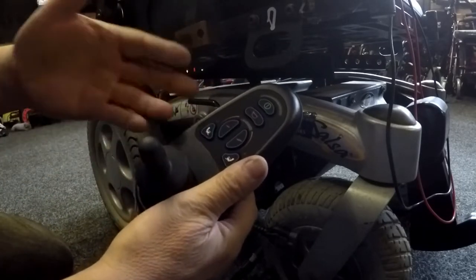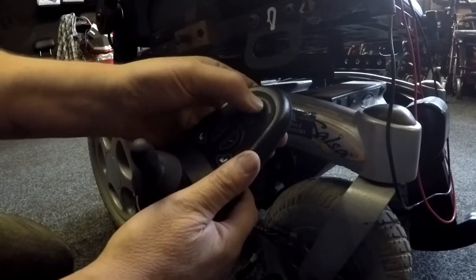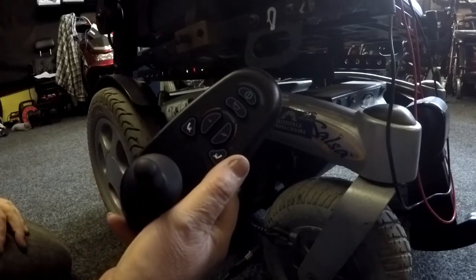There is a problem. There's somewhere a problem. Switch it on, it switches itself back off. It went on there, the electric brakes went, and now it's not even switching on. So this is a brand new box, so there must be a problem elsewhere.